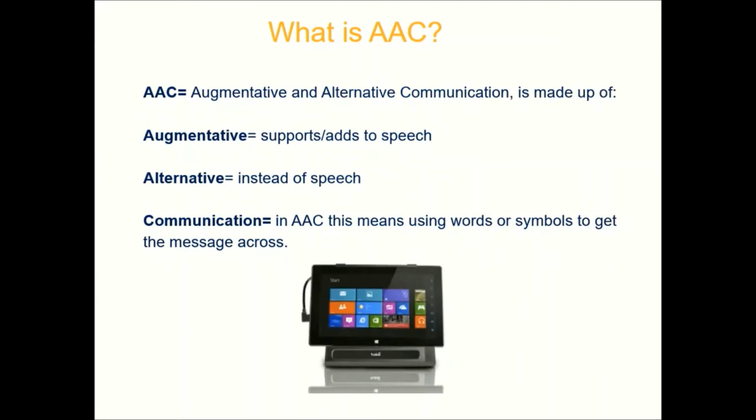So AAC stands for Augmentative and Alternative Communication, and essentially it's any system or device that helps someone to express themselves when their speech is unclear or they are not able to use speech at all.